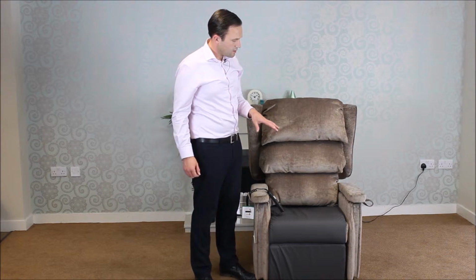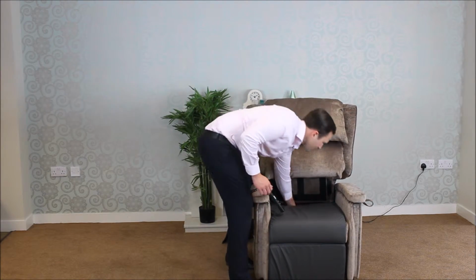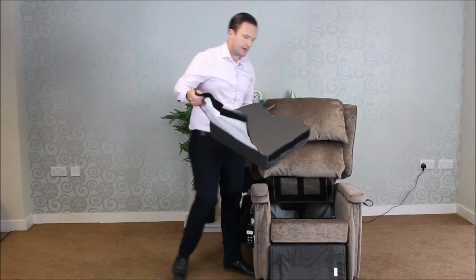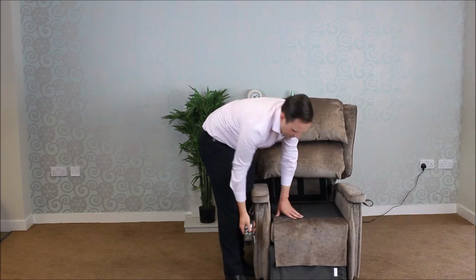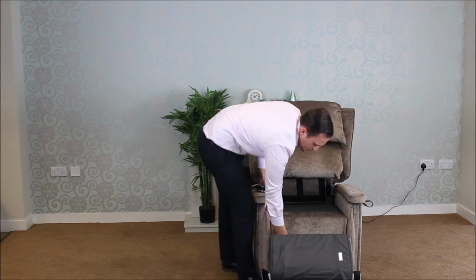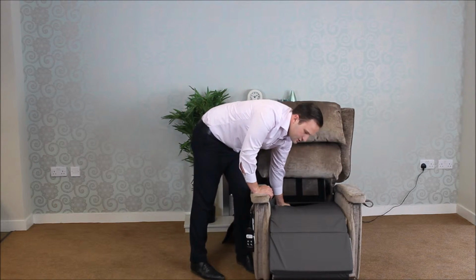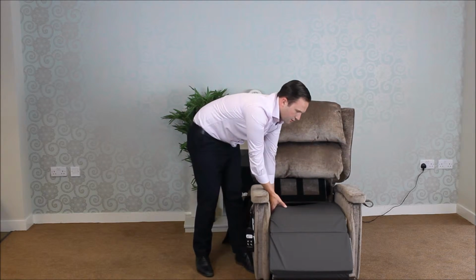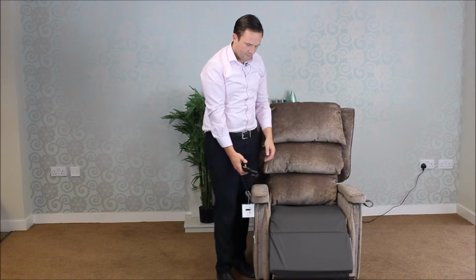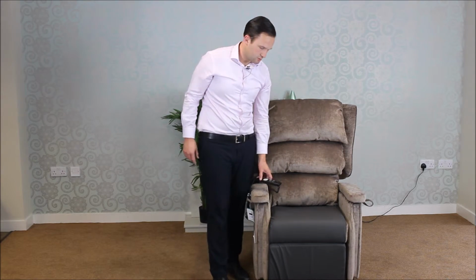The other thing to look at is the cushion in the chair. We do have different cushion options that can be used, and the cushions are quite easy to remove, like this, and we have different types of foam that can be tried. As standard, the Configura Rise and Recline comes fitted with a visco cushion, which has a high risk pressure reducing foam. We also have what we call a castellated cushion, which is similar to the visco in terms of performance, but doesn't have visco foam. Some users, especially if they've got reduced core body heat, don't get on with the visco cushion. So you've always got the castellated cushion to try. We also have a dynamic cushion, and if none of those options work, we have a drop-in self-supply overlay, which allows you to insert your own cushion. There's a separate video on how to use that, which you might want to watch.